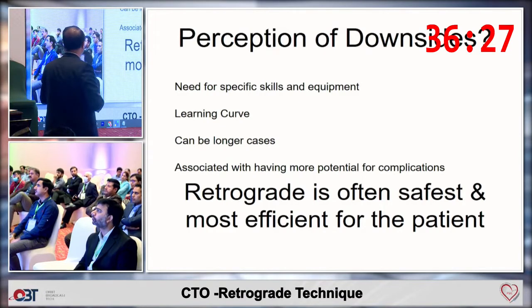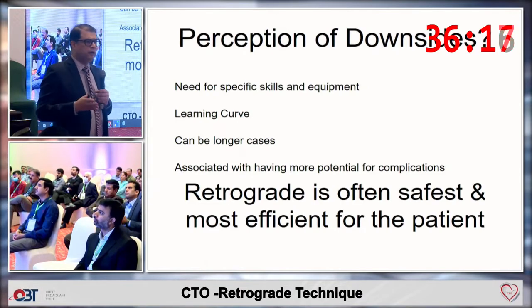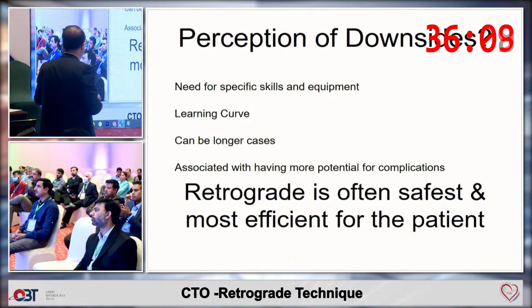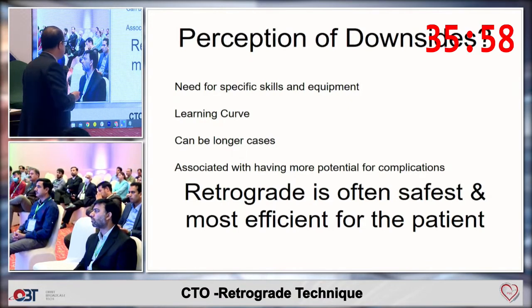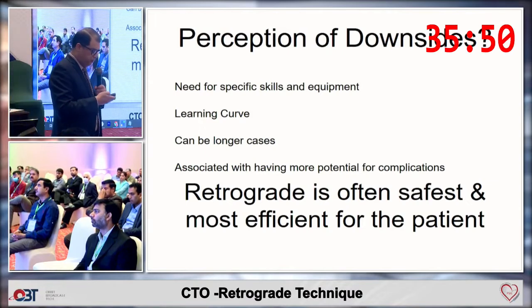So all you need is skills and equipment. There is a steep learning curve because you have to be proctored and assist a lot of retrograde CTO cases before doing them yourself independently. And definitely, there is more potential for complications. But in experienced hands, it's a safe and efficient procedure, especially the Japanese operators. They are very good at doing retrograde.